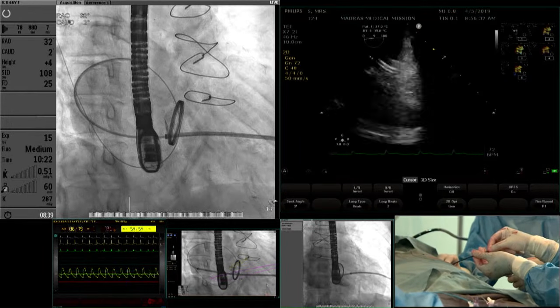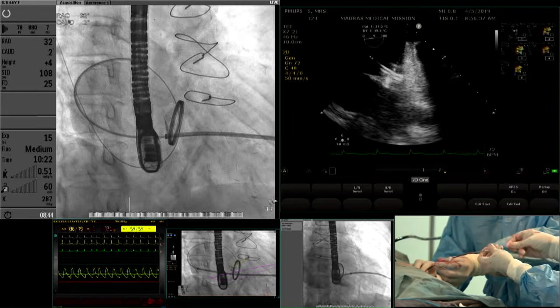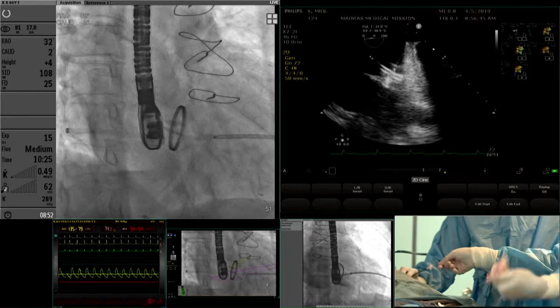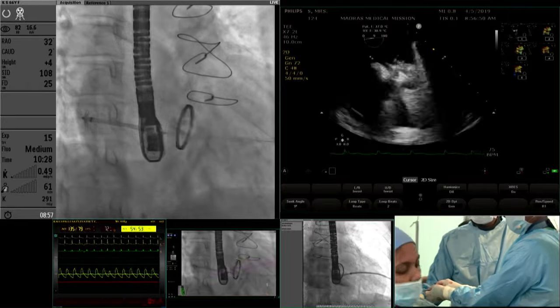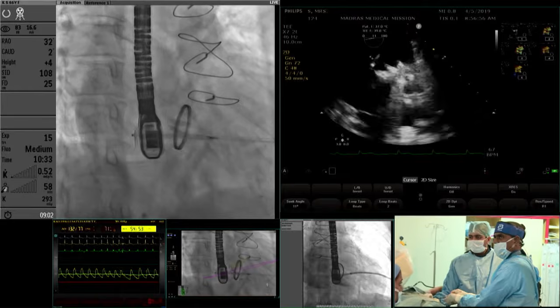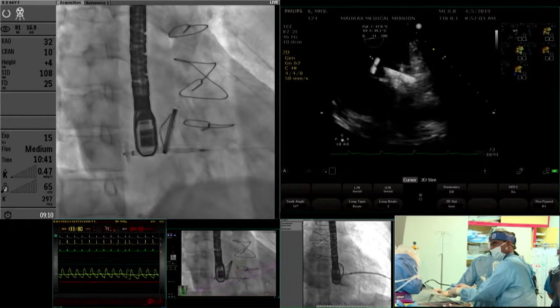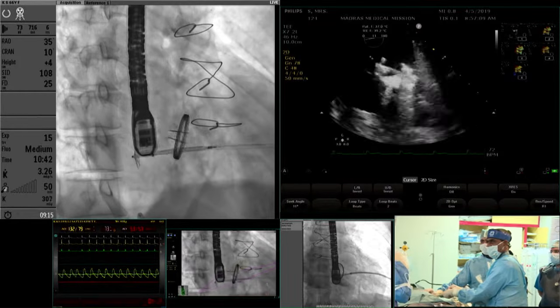So which size do you finally choose? This is 16 or 14? 16. 14. Okay, sorry, it's 14 now. So I'm going with a 14 now. You see that this is a 14 Amplatzer vascular plug 2. So I have released the distal part of the device. Now, can you get it sent cranial or caudal and make the disc completely come perpendicular? Okay, okay, okay. So I'm releasing another 50% of my device.